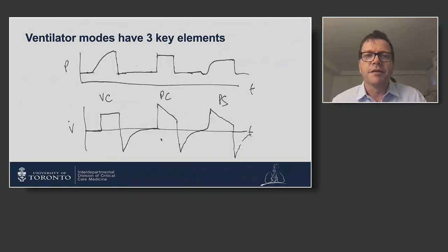So if we go back to what the different modes look like, here we have pressure support. On the end, a little dip in the pressure tracing, just indicating that this was definitely a patient-initiated breath, and then the ventilator's mission is to give flow to make the pressure tracing look something like that. And that results in usually a decelerating flow waveform like this that cycles off once this value here is about 25%. That's the default level usually of the peak inspiratory flow.